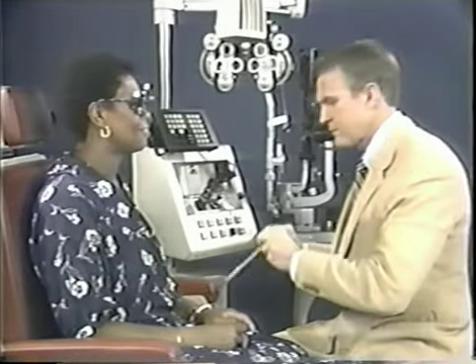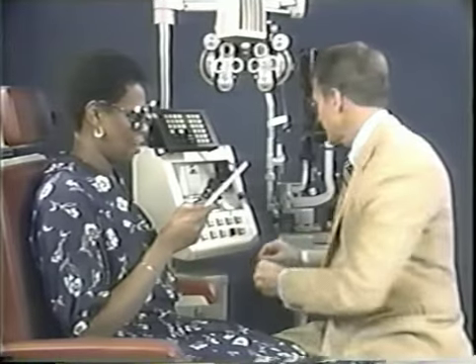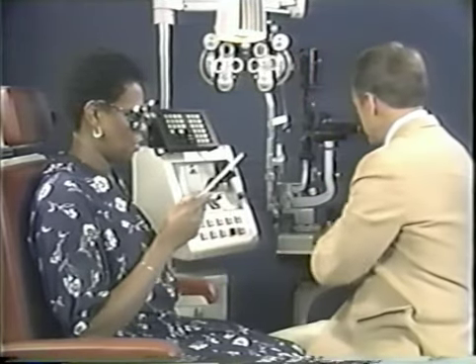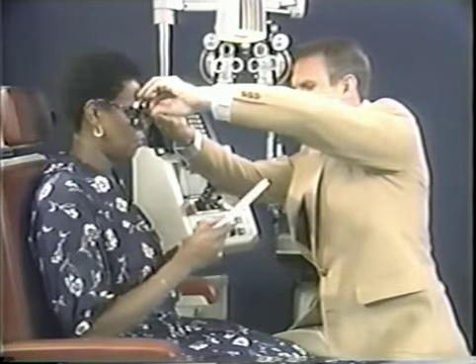With the trial correction in place, the patient is given a reading card and asked to move the card toward her or away from her until the print blurs in each direction, thus exploring the useful range of near vision. If the range needs to be moved closer, the power of the reading adds is increased. If the range is too close, the power of the reading adds is reduced.